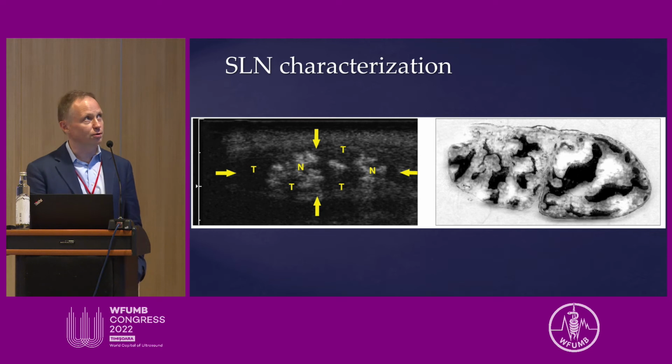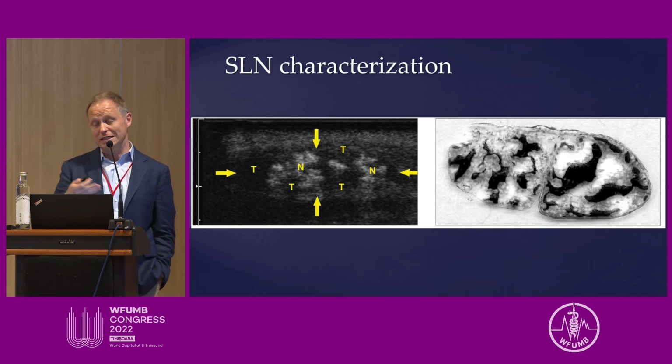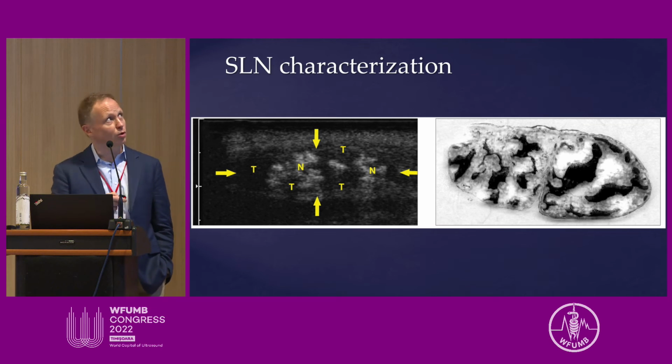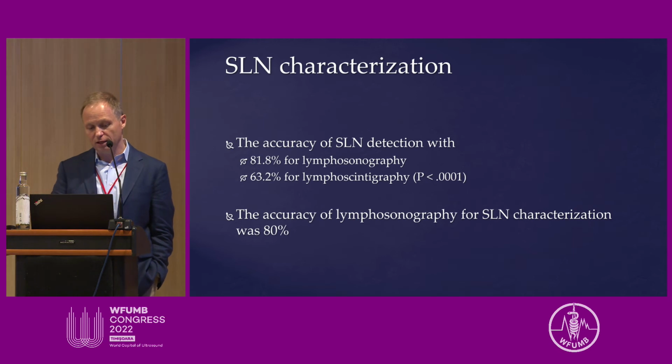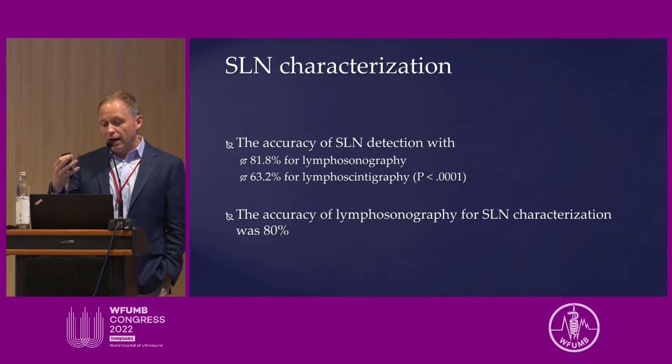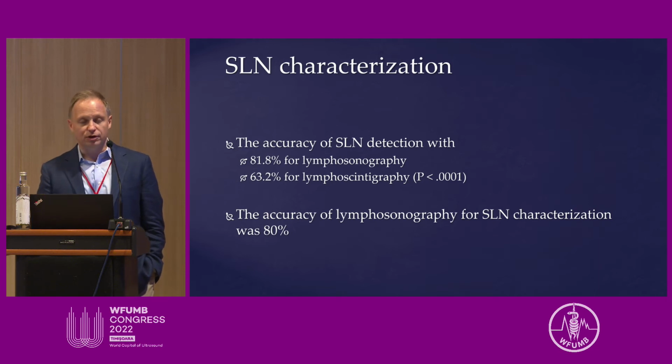Metastatic lymph nodes with patchy tumor involvement, and also reactive lymph nodes with edema, will also block some of the channels and prevent microbubbles from getting in. So lymphosonography is very good in detecting lymph nodes, but it's not very good in characterizing them.